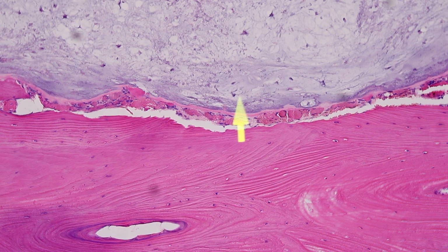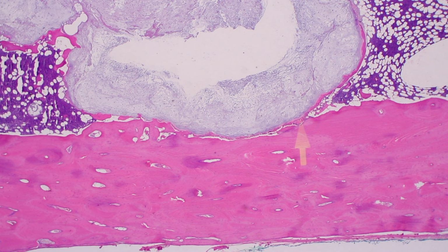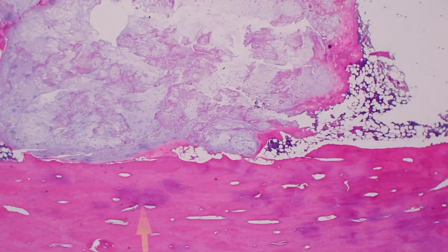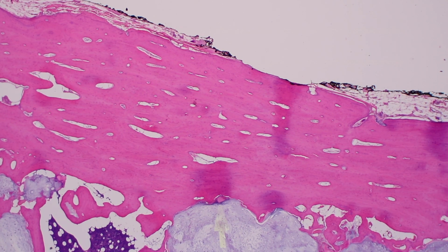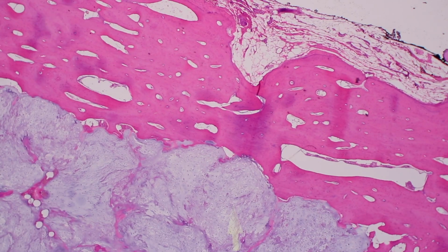We are now moving into the area along the endosteal surface where we should have the inner layer of the circumferential lamellae. We can see that this eccentric nodule of hyaline cartilage is impinging upon the internal surface of the bony cortex. And what will happen over a period of time as this cartilage nodule increases, what will it do to the cortex? It will result in osteoclastic resorption of the cortex, producing a scalloping of the internal layer of the cortex, which you can get an idea is present here and is present here.